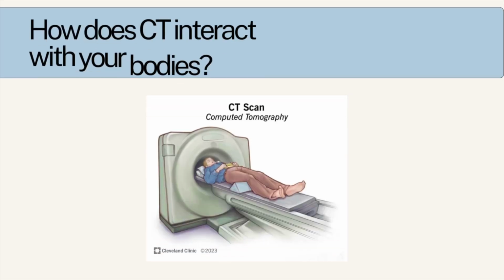So thank you, Dr. Nguyen, for explaining how CT basically works and the general mechanism of it. I'm going to be delving further into how CT will interact with our patients. So basically, in the gantry, which is the donut-shaped part right here, you can see there are two main components, which Dr. Nguyen has touched slightly on, being the X-ray tube and the photon receivers.